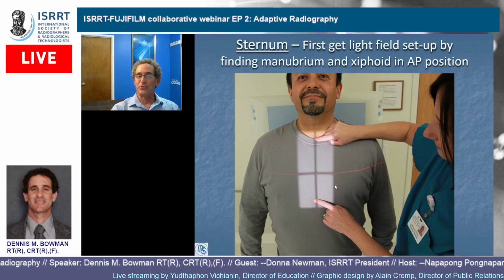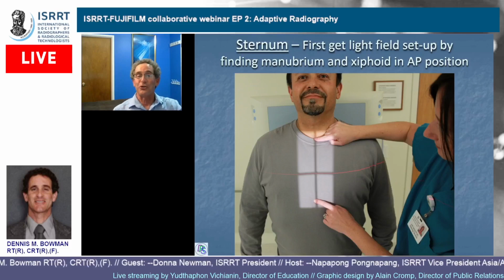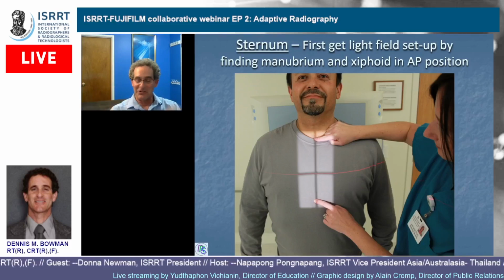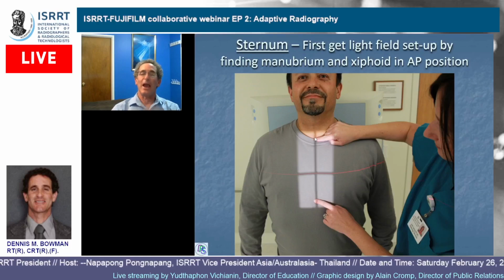Here's a great sternum trick. For those of you that saw my big long talk, you've already heard the sternum, which is why I won't tell the whole sternum story again, with that I'm the sternum master, but I will show you how to do a sternum for all of you that haven't seen this trick. And what you're going to do is pretend you're doing an AP sternum.